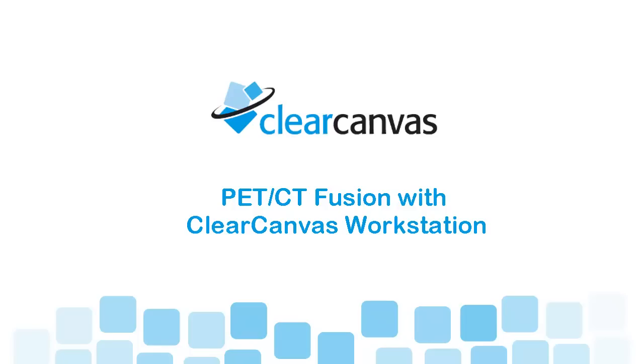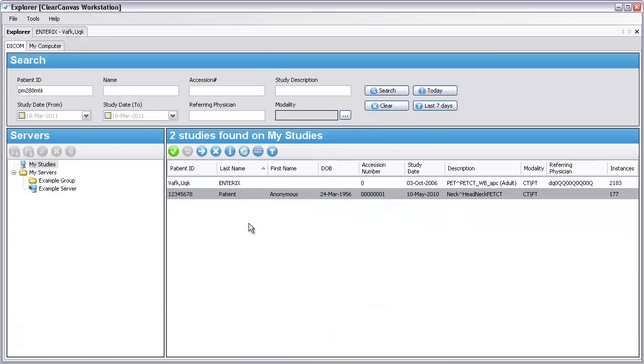Hi, my name is Jonathan and I'm a software developer at ClearCanvas. Today, I'm going to introduce the PET-CT Fusion feature that's part of ClearCanvas Workstation.